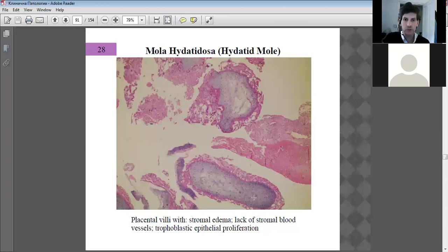What we've got to look for in such slides is, has it become carcinogenic or not? The slide here indicates there is some necrosis. I can see there the spots of necrosis. However, the border tends to be fairly normal in this mole, or section of the mole.